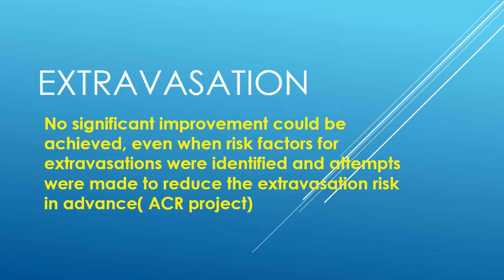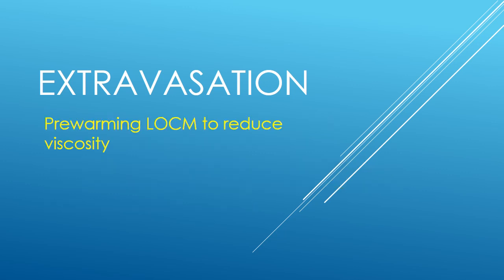Now, there was an ACR project which came out with a very surprising finding. They say, whatever you do, you may not achieve significant improvement. And then somebody suggested: why don't you pre-warm the low osmolar contrast media to reduce the viscosity?